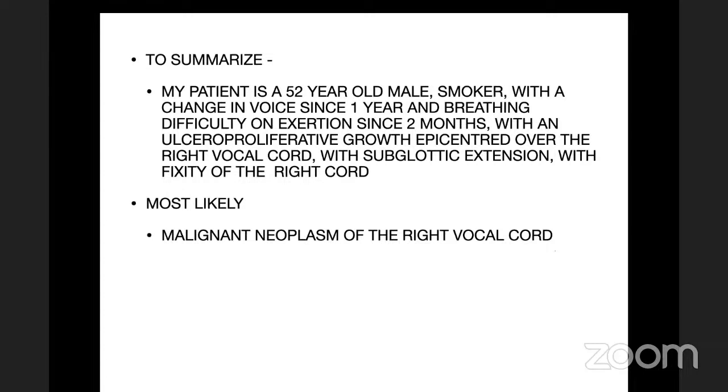You may actually do reformatting after you've taken the cuts. We don't do 1 millimeter cuts for an advanced glottis. For an early glottic cancer, I would agree that you do a 1 millimeter cut, predominantly at the level of the glottis, to see the extent of spread. But in a large advanced cancer, it's not mandatory. And in one breath, you said I'll do up to the mediastinum at 1 millimeter cuts. That's why I felt it was a little too much.